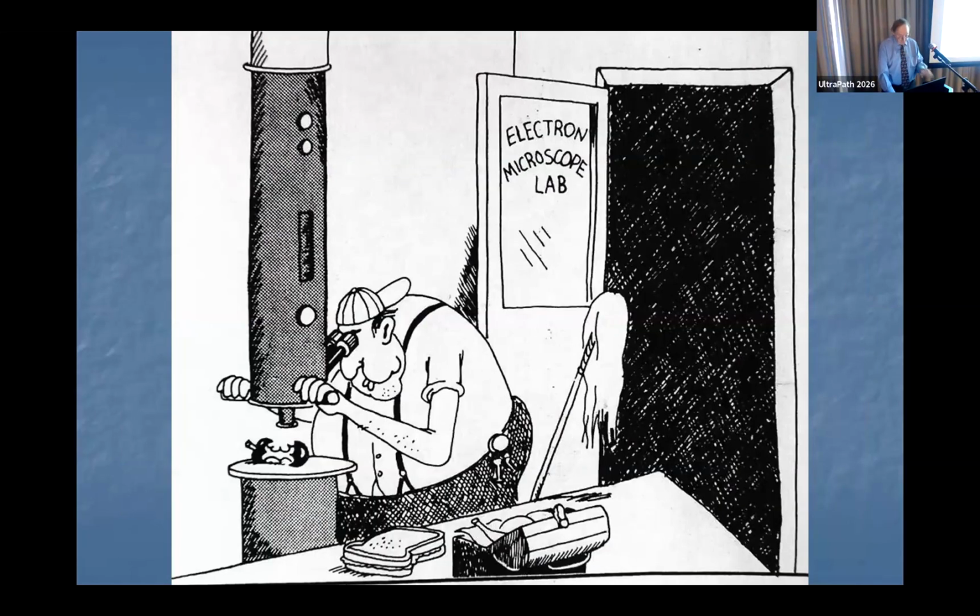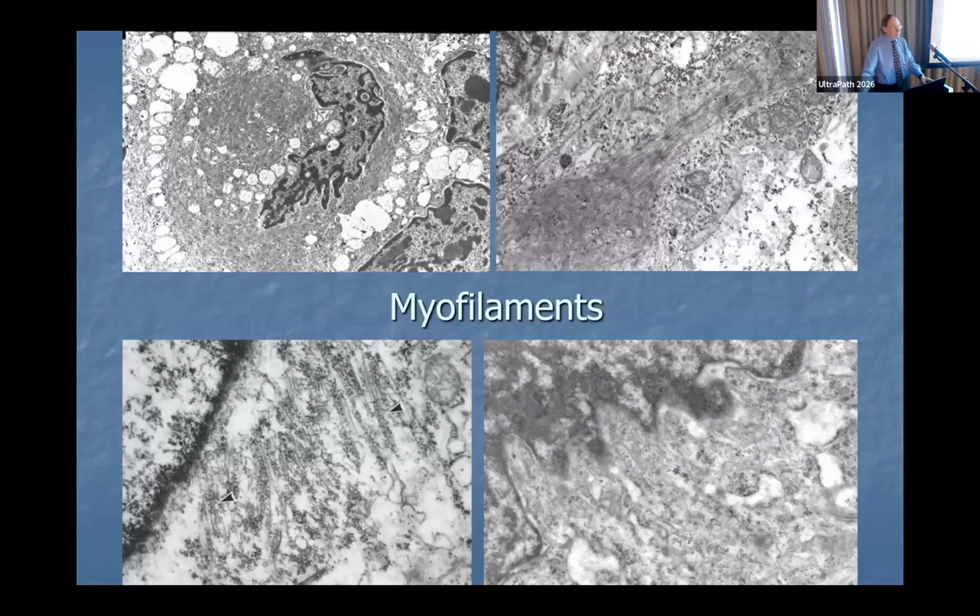This is one of our technicians working on the case. Very highly skilled. And this is what I found. I actually found a classic rhabdomyoblast. I found variations of myofilaments, from areas where you see myofilaments with Z-band material, to other areas with very rudimentary myofilaments, which have a very fine fibrillary structure and a lot of times are just attached to little ribosomes. So this took me to rhabdomyosarcoma.